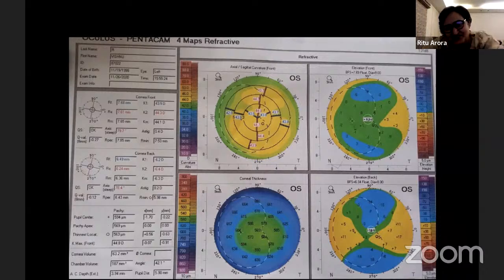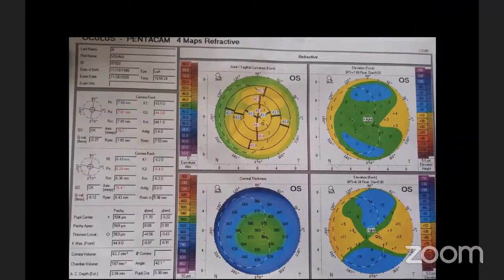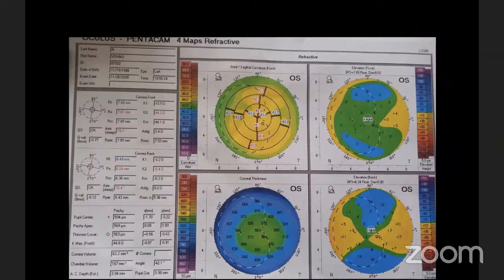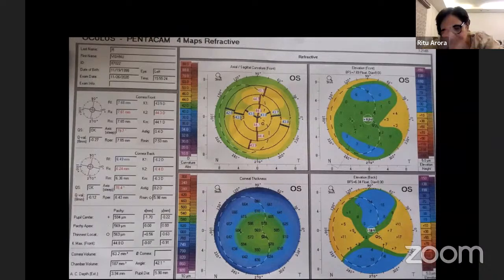Yeah, because here the question would be this. Rest, whatever you said is okay. And what is the central elevation you're seeing over there? Max elevation, what's written over there? That's something where you have to concentrate. How much is the elevation coming there? Is it plus 11? What is it, Anil? Central green elevation plus... 1, plus 4, plus 4. Plus 4. Okay. So it's normal. Is any importance to be given to that? No, ma'am, it's normal. Okay. And just look at what is given, so just compare those things.